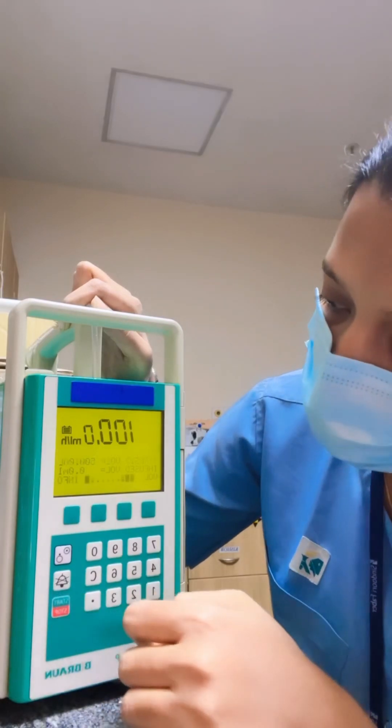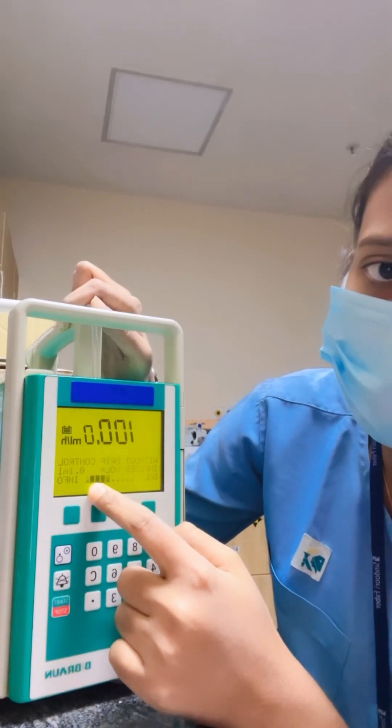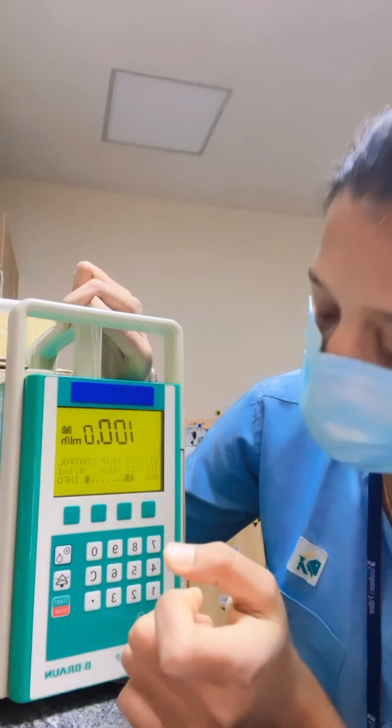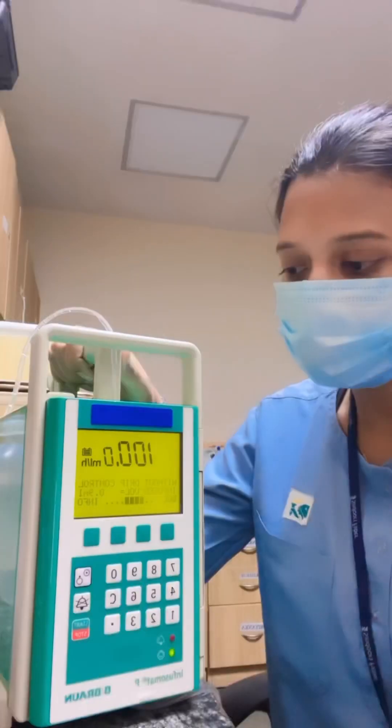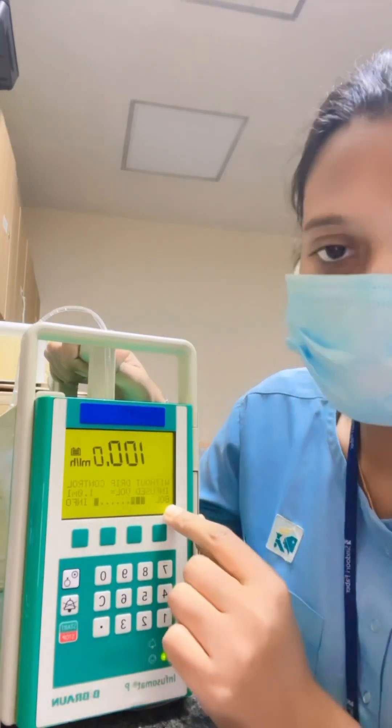For starting the infusion, press start. You can see this moving line, which means the infusion has started. Now the main question is how to give a bolus.